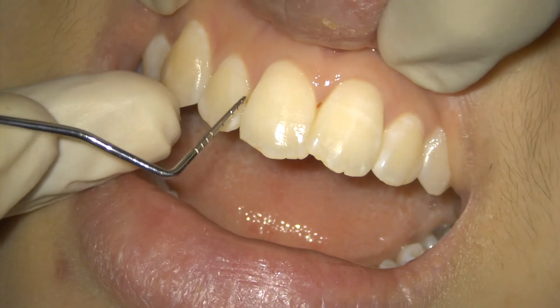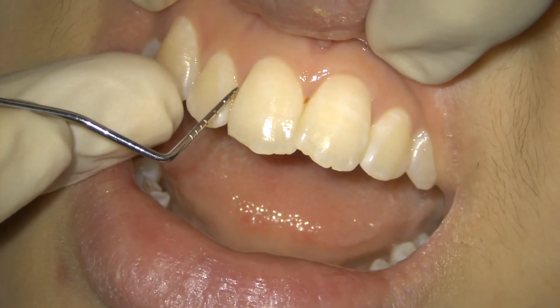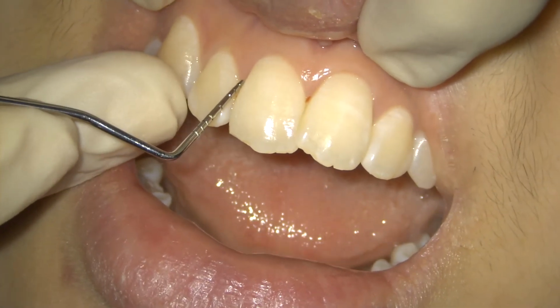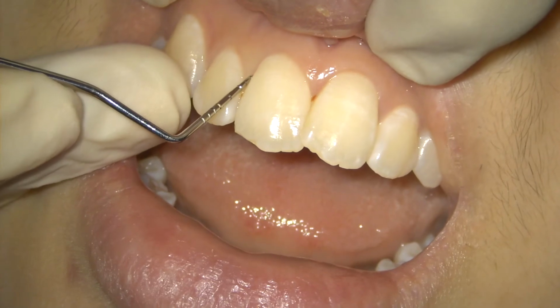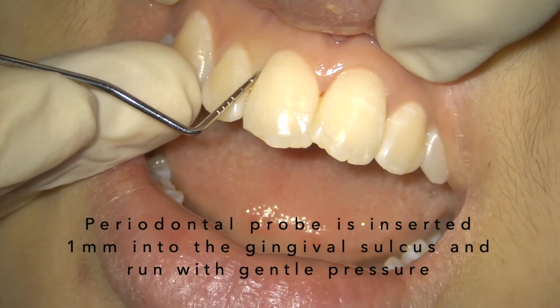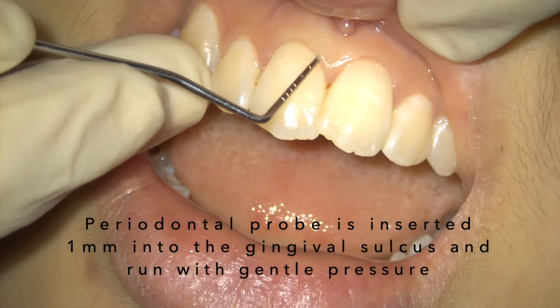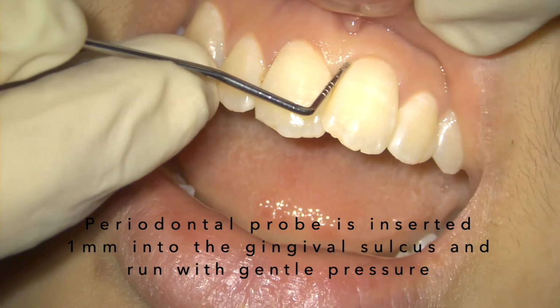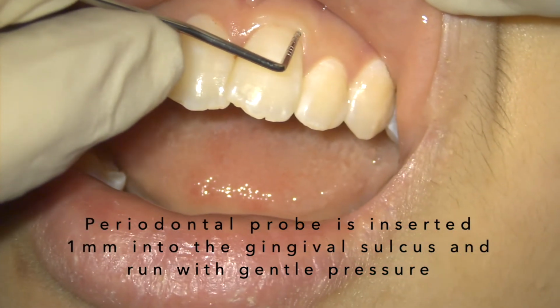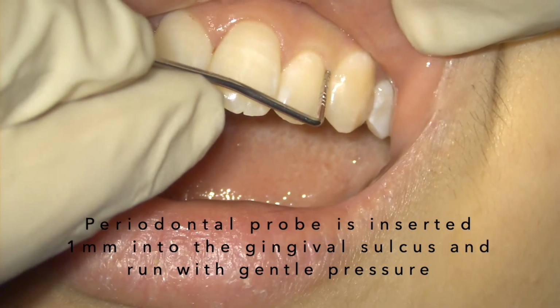For recording purposes, to make it clearly visible to you, I start from the central incisors here. Okay, you take your periodontal probe, Williams periodontal probe or any other periodontal probe, and you start probing at the sulcus of the distalmost part of the tooth, and then you run 1 mm into the sulcus like this. You just go on, carry with a gentle pressure, not much pressure, carrying the probe lightly 1 mm within the sulcus. You can go on like this.